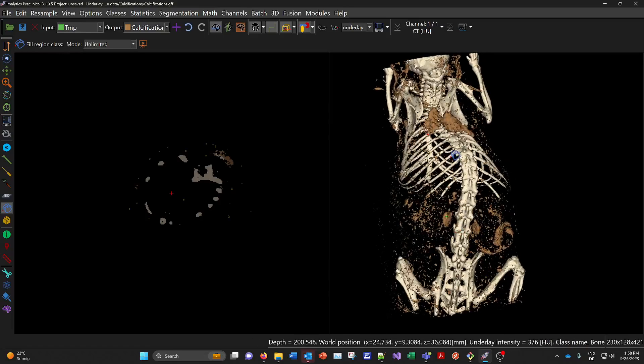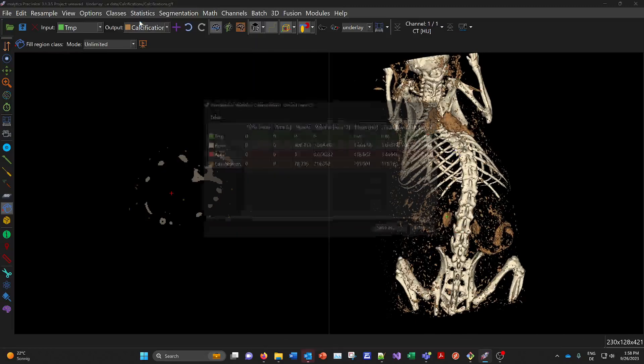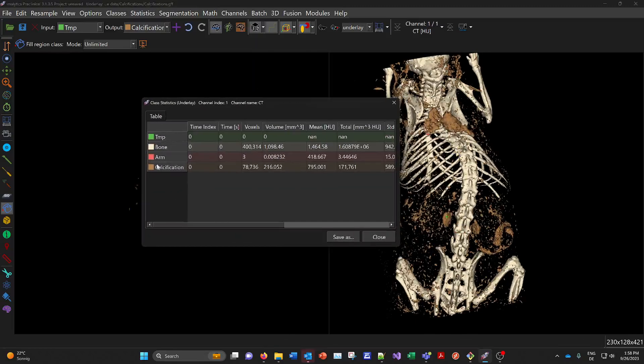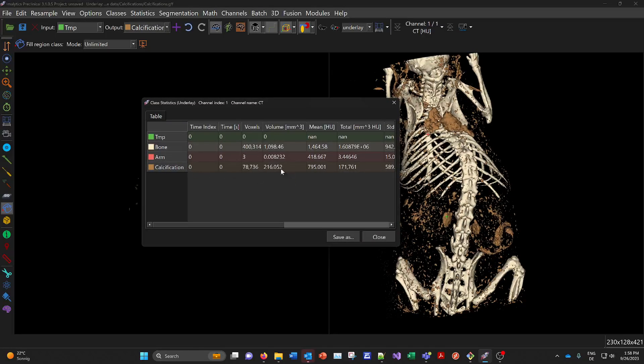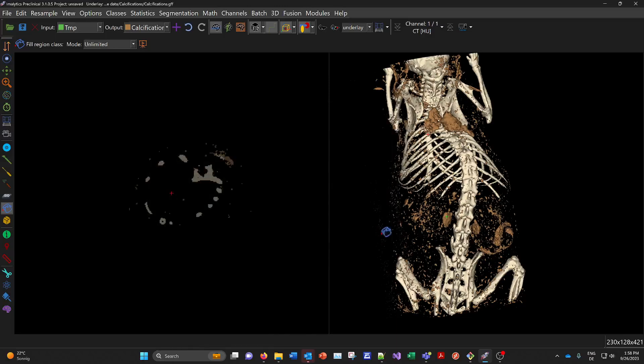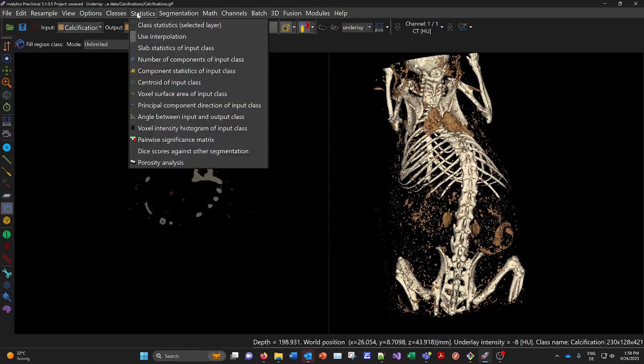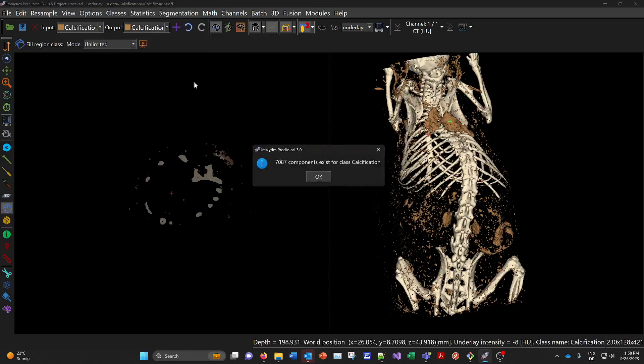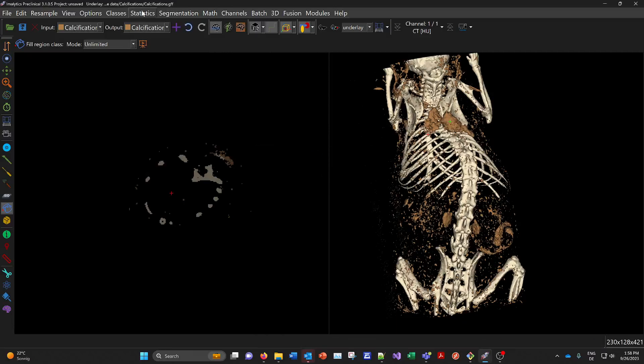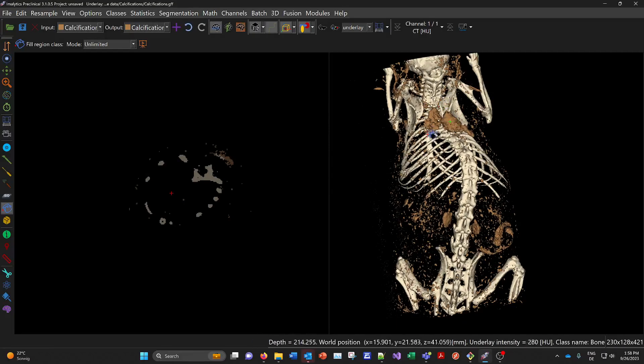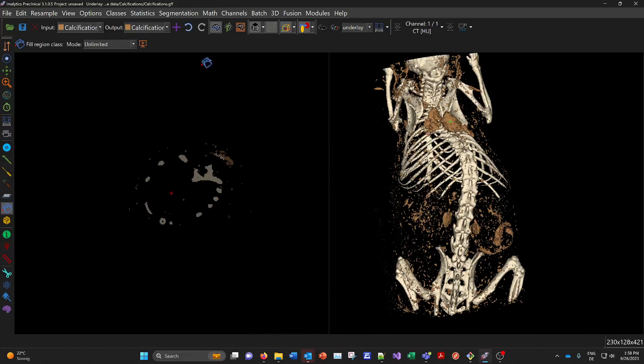And we can quantify their volume for example, their total volume here with this menu. And entry. And you see the total volume is this here. And the brightness here. Hounsfield units. And you can also get the number of components here. Number of components. 7000 something. Quite a lot. So that means it's 7000 small guys here that are disconnected.